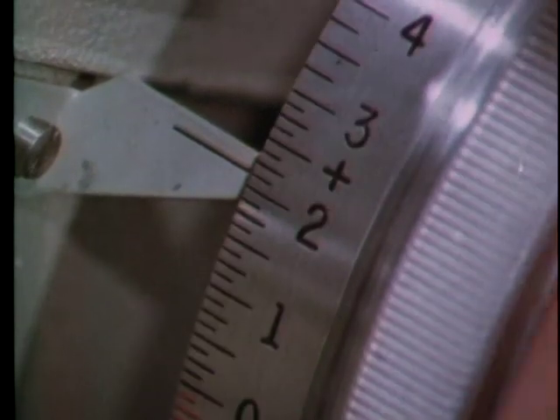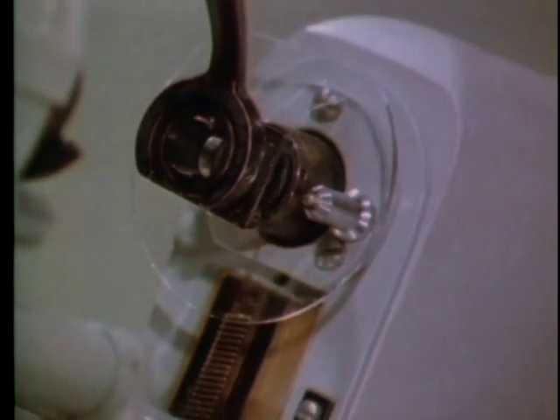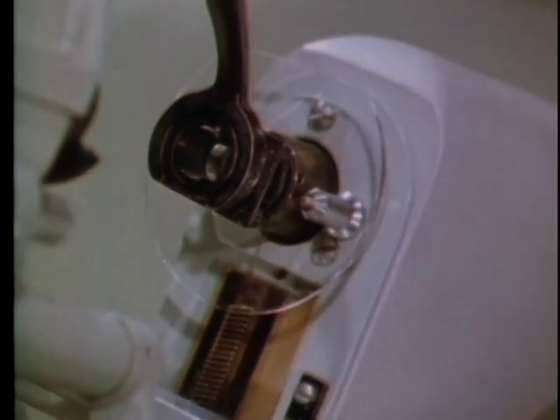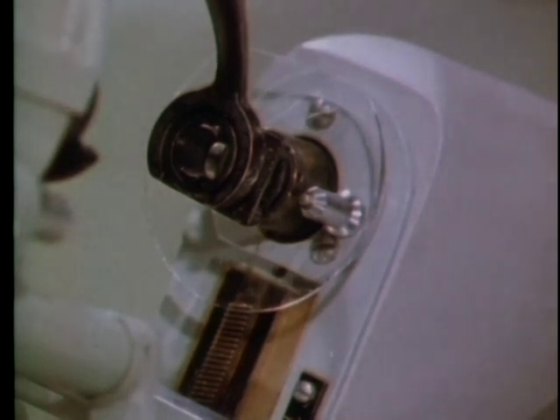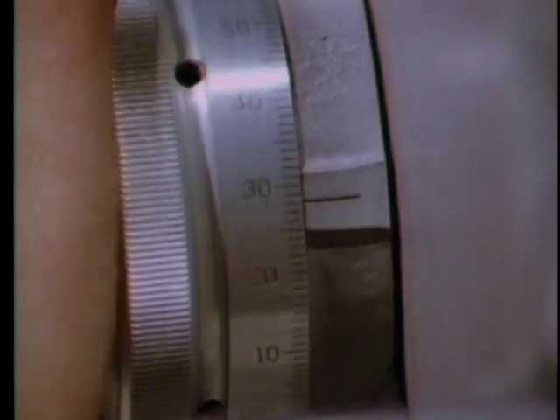As before, you turn the power wheel until one set of lines comes into focus — again it's the thin set of lines you want first. Suppose you get the thick lines instead. With a bifocal, you do not turn the lens since you want to keep the segment at the bottom. What you do is turn the axis wheel until the thin lines come into focus and are unbroken.